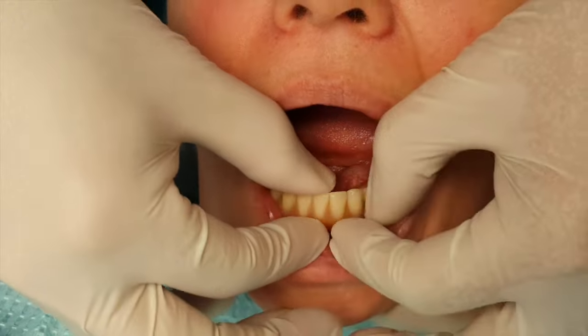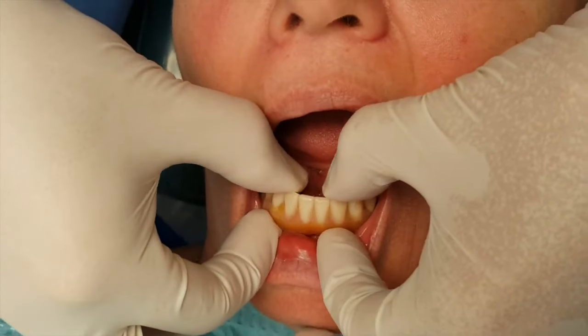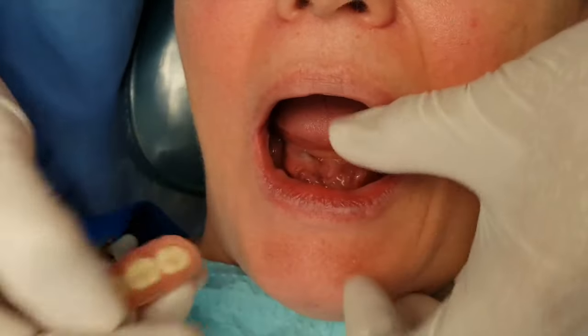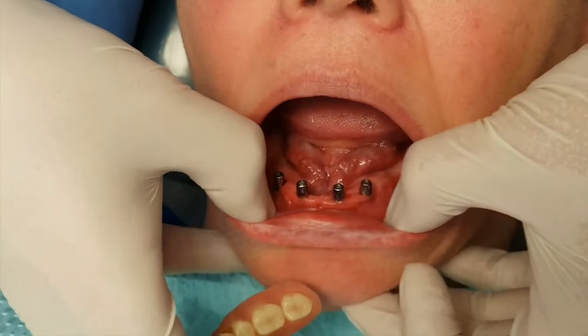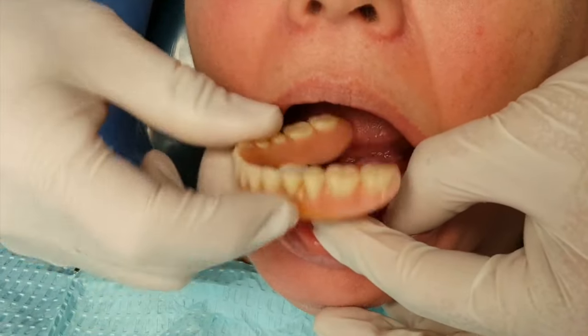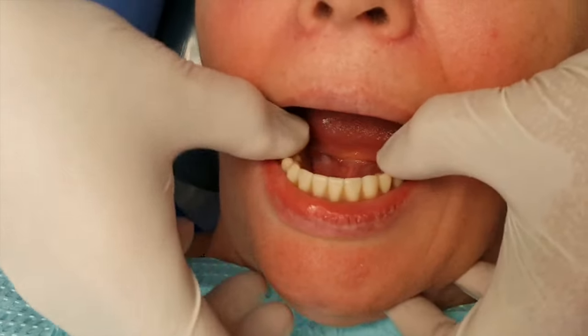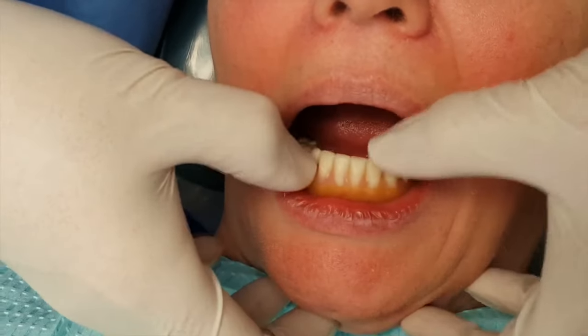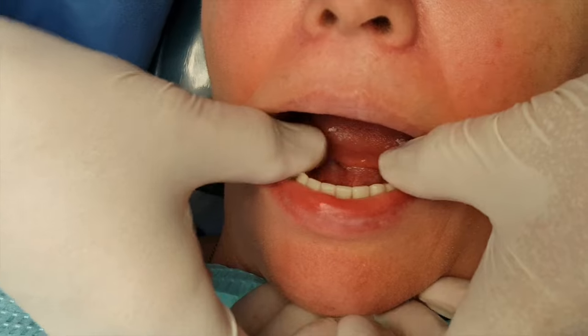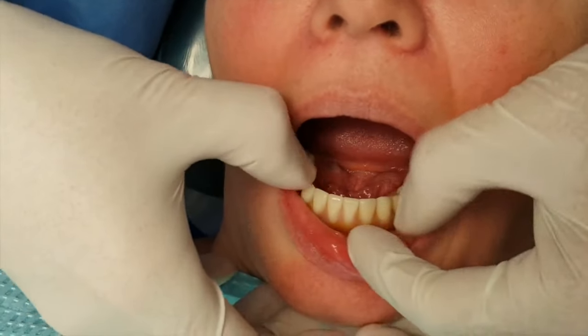I'm going to remove the denture — there we go, that's pretty tight. Let's put this back in, but before that, let's show how these implants are looking. It should drop in rather than that — there we go, it's going in.